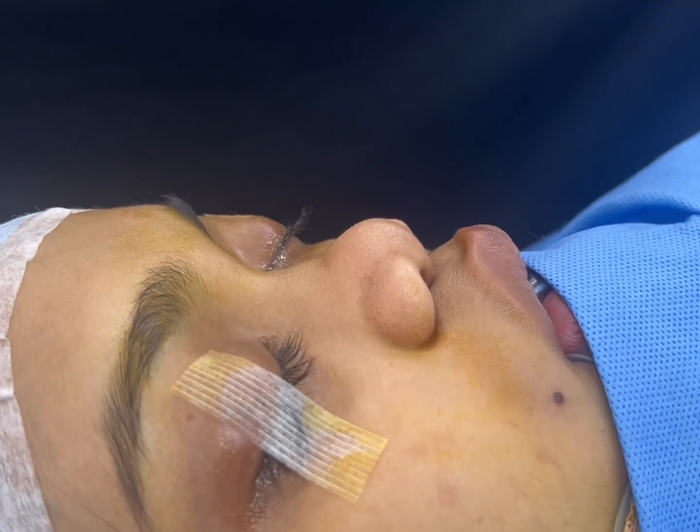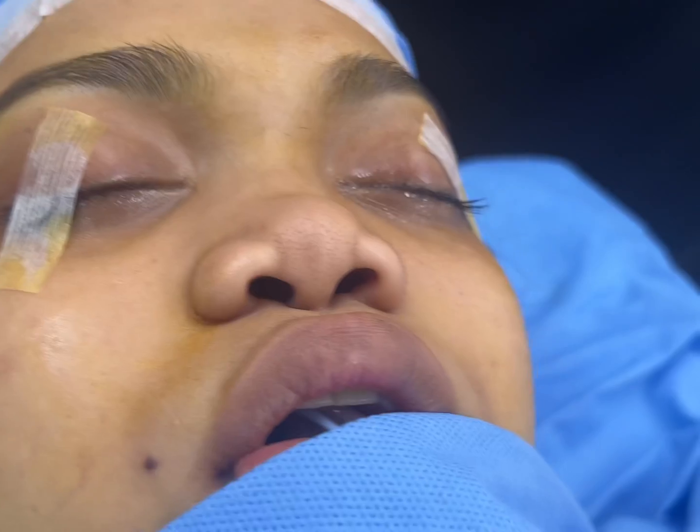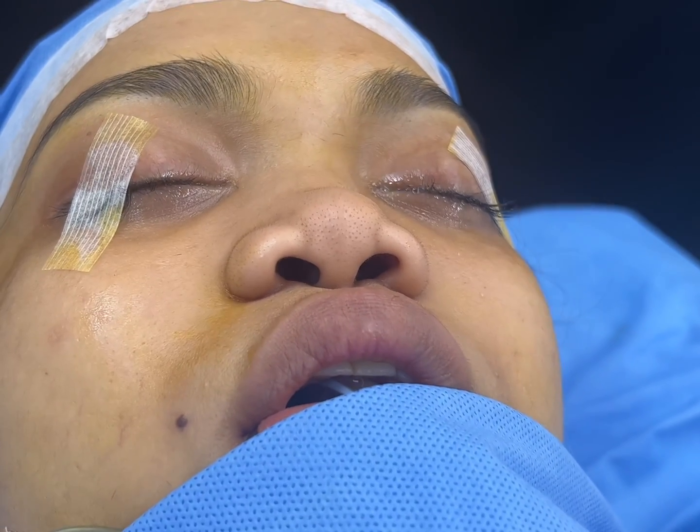We harvested a costochondral graft of rib, using both the bony and the cartilaginous parts of the rib for the surgery.